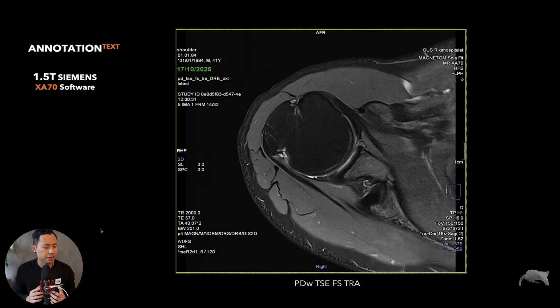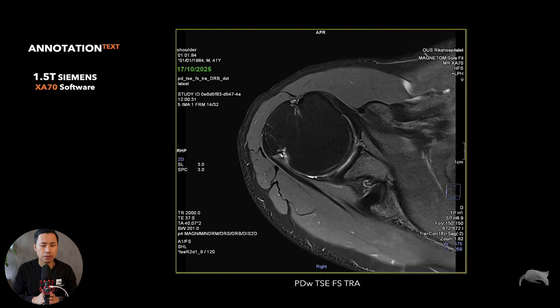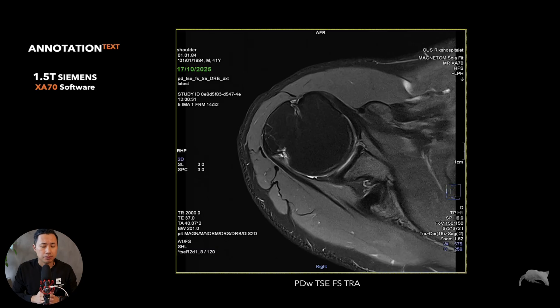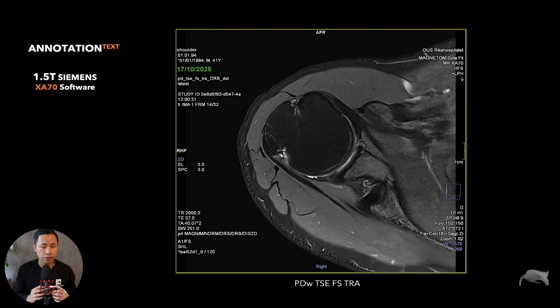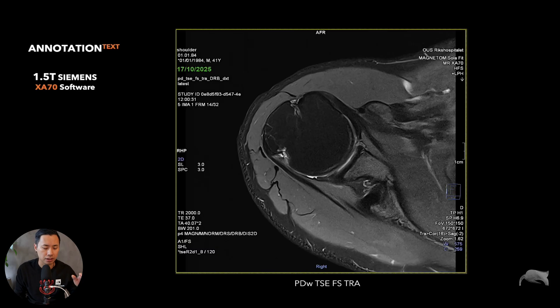I made a presentation for you guys so let's go directly to that. This is the annotation text I'm talking about - you can see this is just a simple PD turbo spin echo fat sat in transversal plane. There's a lot of information in every corner and you can decide if you want that information or not - you can customize it. But for me I really like to have it all, just to have an overview of what was used without needing to open up the sequence and look at the different parameter cards.